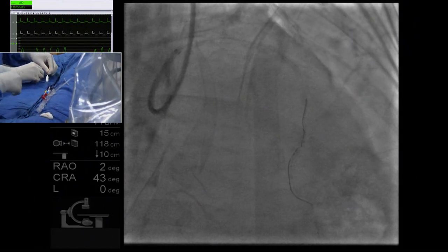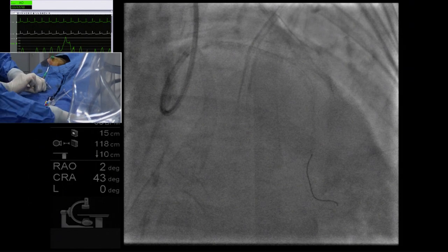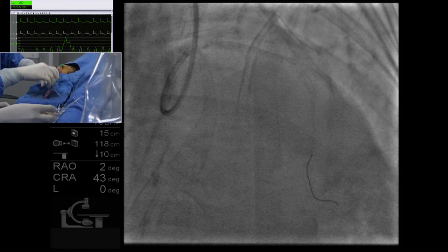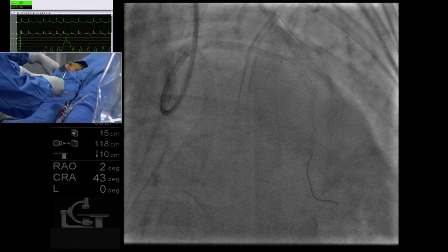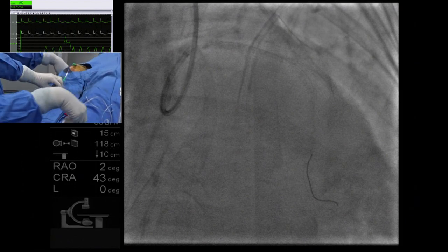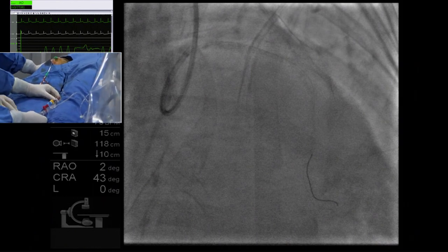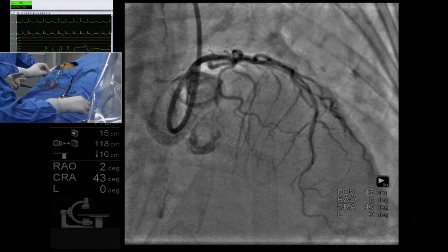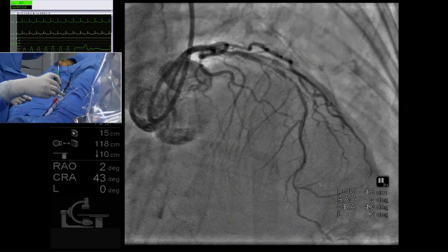You can remove this. Yeah, that's what I was thinking. If the burr is stuck, first thing is to put the wire back, so it's just stuck in the burr, and then we activate the device and pull it out. Now, what is the panel thinking? What is the panel doing if the burr stops? Do OCT. Any consensus? What to do first? 2.5.